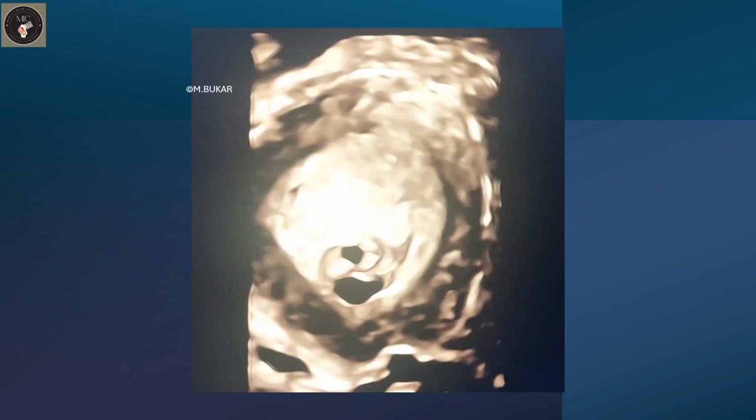So this is the cine loop of the case. Here one can see the 3D cine loop. This is the myometrium. This is the endometrium. As you can see, the endometrium is polypoid with subcystic changes within the polyp, which is a feature of benignity. Note the junctional zone clearly outlined.